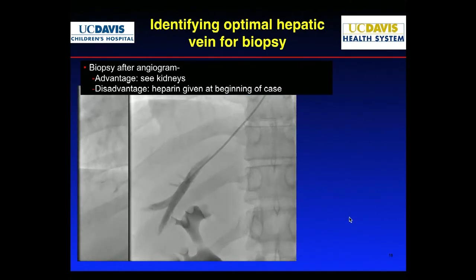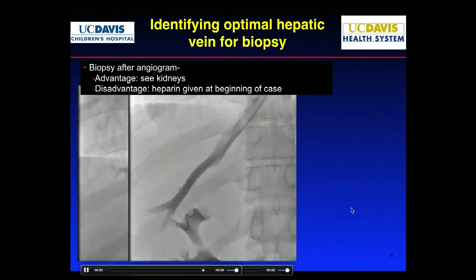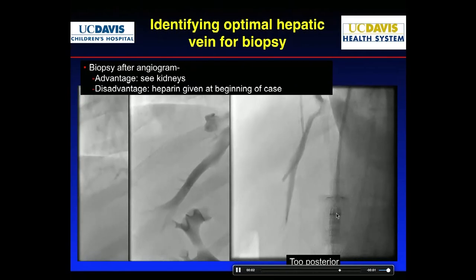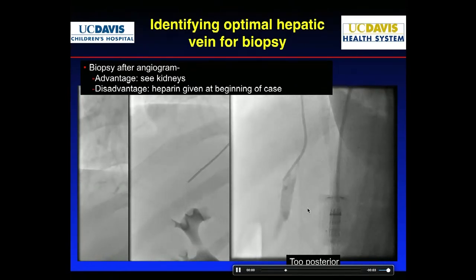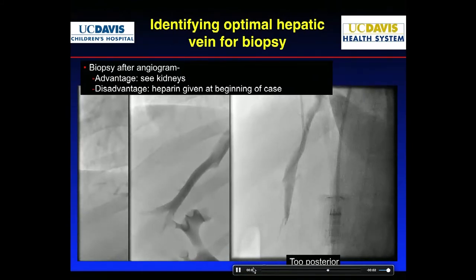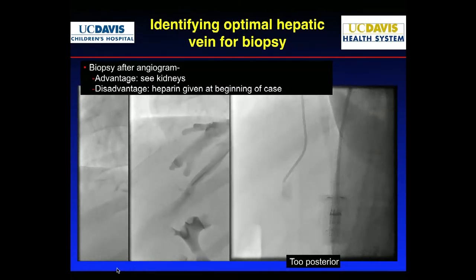And in fact, I did this at the end of the case, but now you'll see that there's a kidney calyces, and you'll see the edge. You kind of know what to expect. Now, of course, on the AP view, it looks like you're going to hit the kidneys with this, but in the lateral view, it's away from the kidneys. The kidneys are back here. Actually, I wish I had a better picture to show the shadows, but this is nowhere near the kidneys on the lateral. So at this point in time, you're going to be staying anterior.